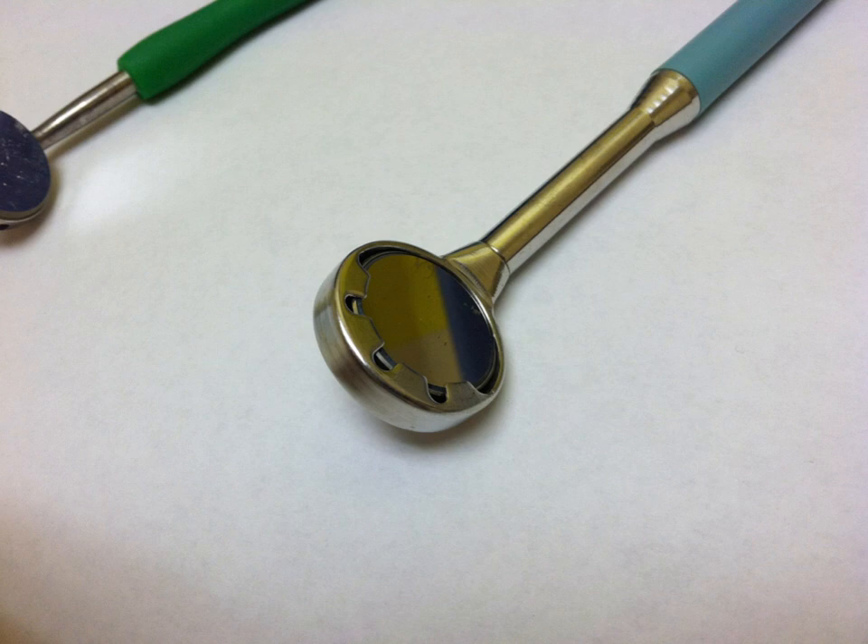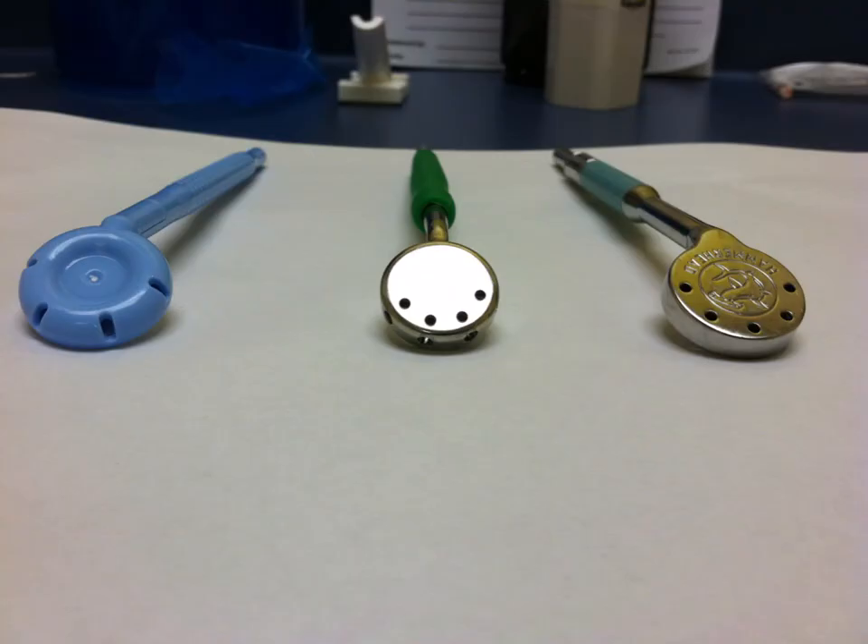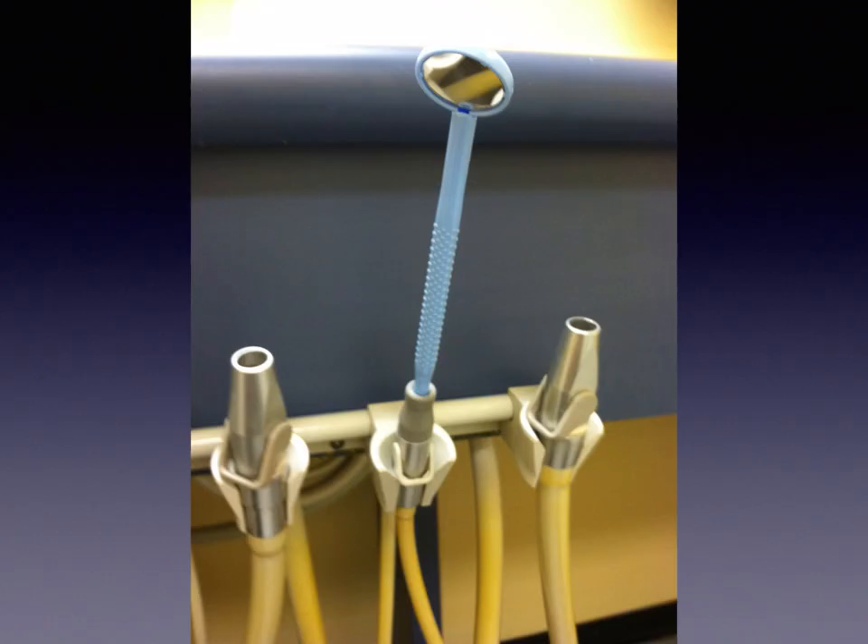Here are all three with the mirror backs visible. The Mirror Vac has four holes in the back and curves to the side a little bit. The Diodent has four holes in the back and four holes on the edge. The New Bird has five holes in the back plus the holes on the front face.